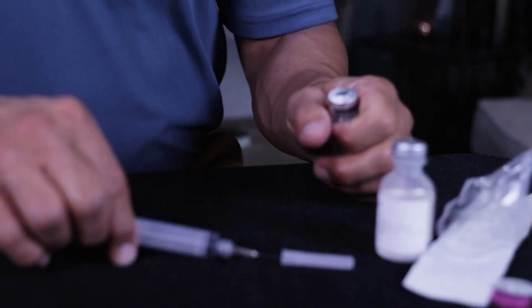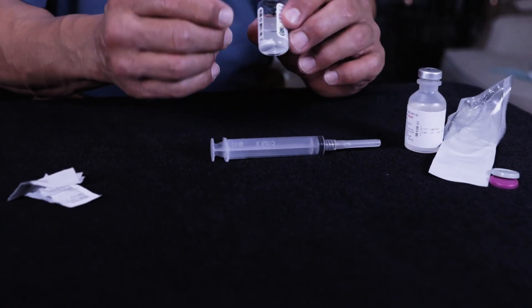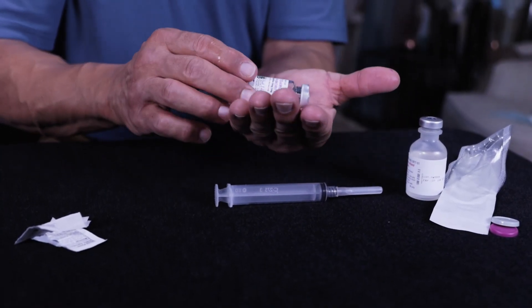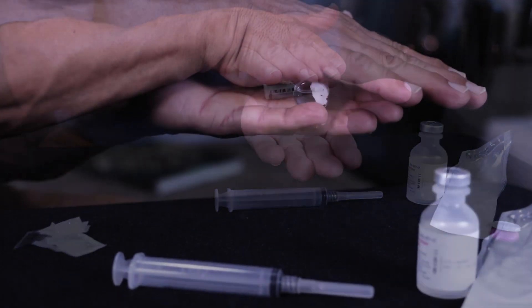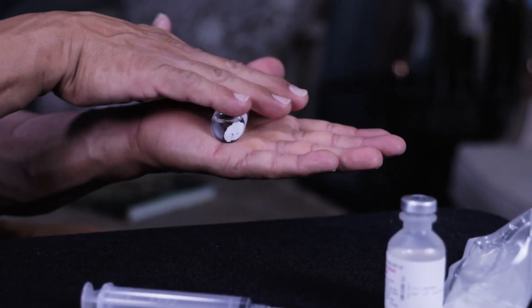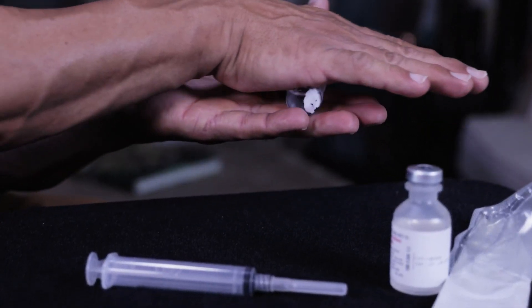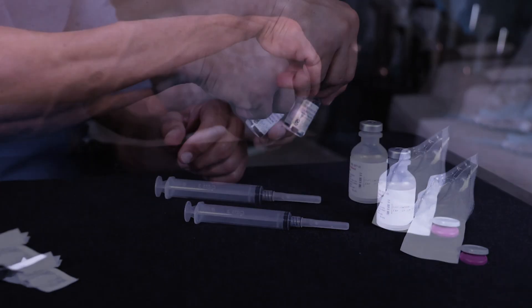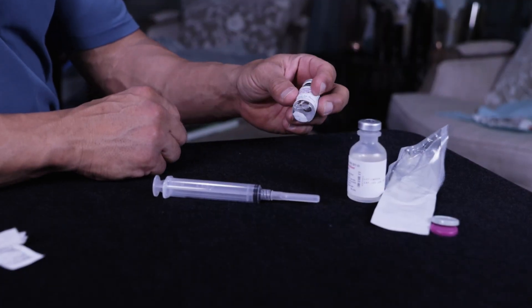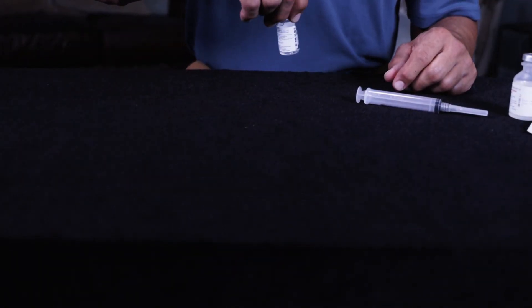Once you've done that, go ahead and recap your needle. Do not shake this bottle violently — you'll notice there'll still be some residue of the peptide. What you want to do is put it in your hand and roll it, just like that. You can roll it between your hands or give it a twirl, but do not shake the bottle. It may take a few minutes, but it'll eventually dissolve into the liquid, and all the product will be dissolved into the solution.